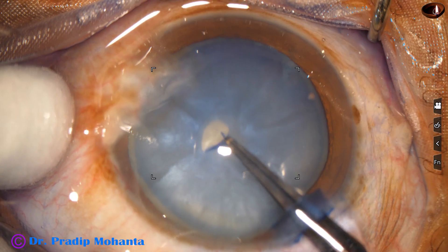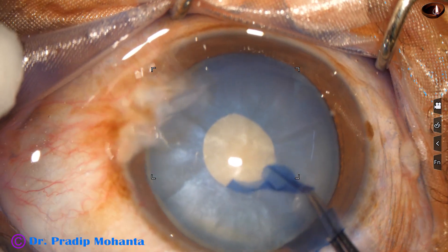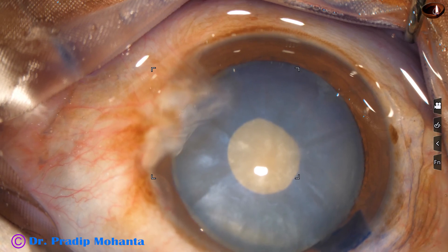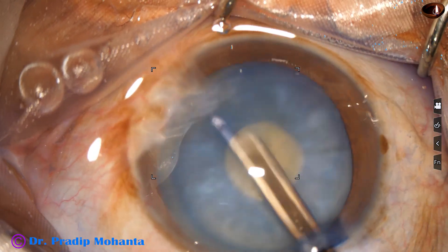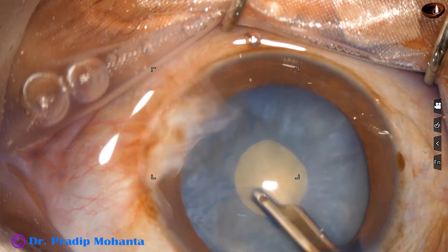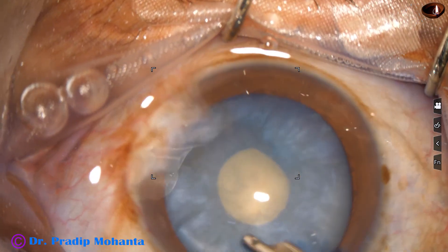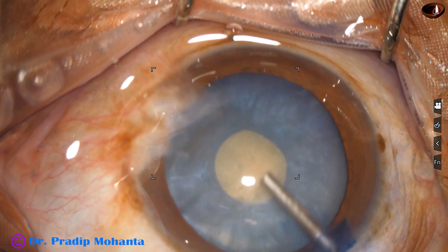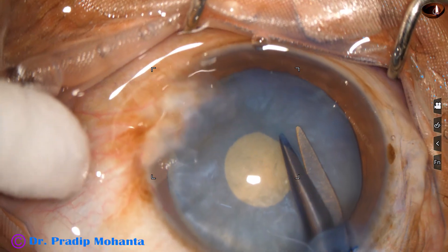My plan is to do a small rhexis first. With the help of this utrata forceps, I could do this. Now through this opening, I will aspirate some lens matter with the help of the 23-gauge Simcoe cannula. As we remove some lens matter, the intralenticular pressure goes down, and we can easily enlarge the small rhexis and do an optimum size rhexis.